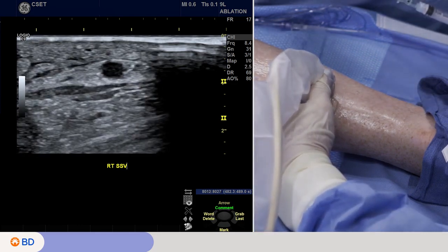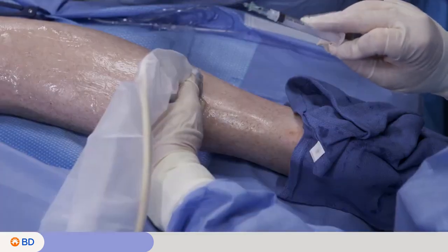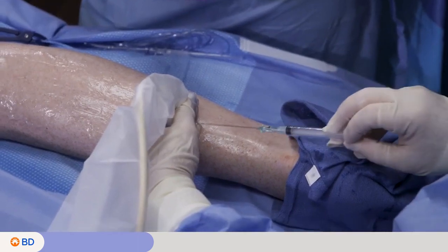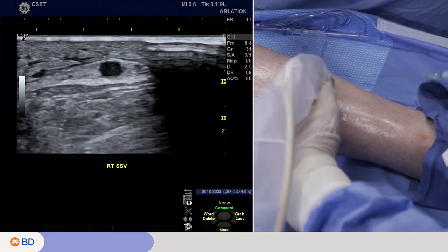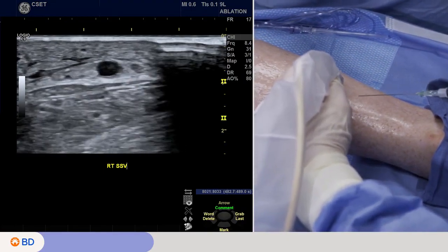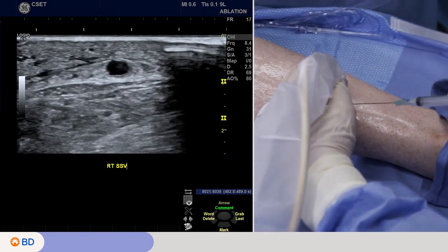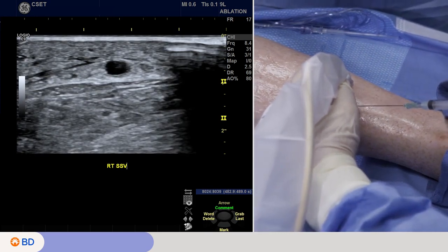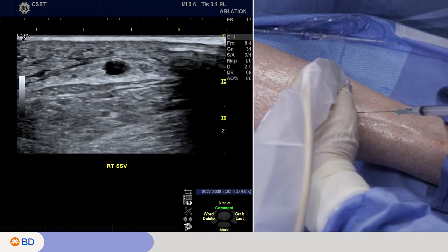So then I have the introducer needle. There's an indicator showing the bevel up on this, and we always want the bevel up to help advance the wire in. I want to put the target of that small saphenous directly in the middle of the ultrasound field, because then I'll pick right in the middle of the probe and use a 45-degree angle for my approach in. And so I've got it numb.